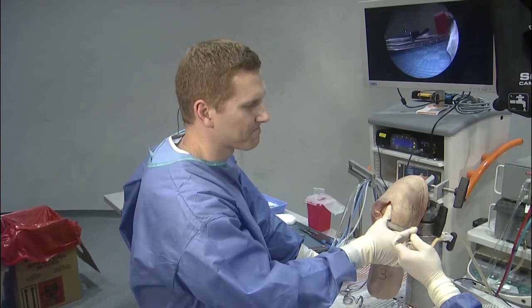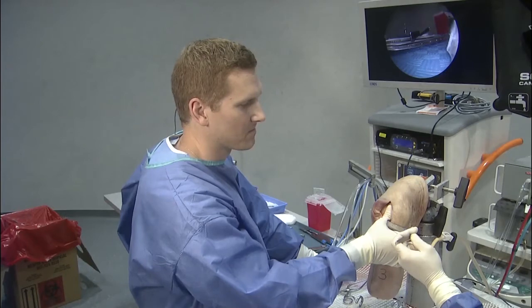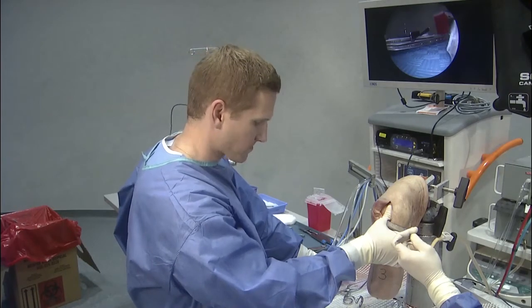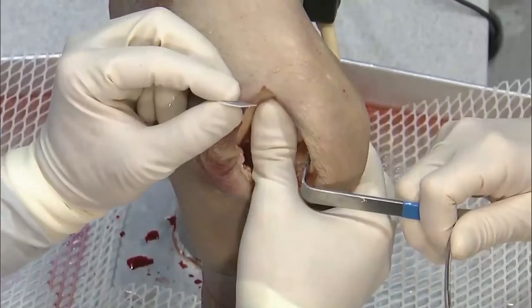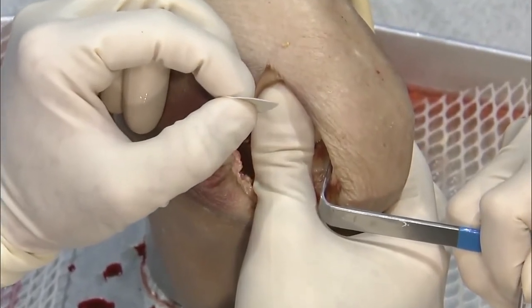Yeah, the other thing that's a little different about some of the cell-based matrix associated technologies is the thickness of the implant. Sometimes the thinner implant's nice because you know it's not going to be proud compared to the surrounding cartilage. Some of the implants are a little bit thicker, and I've had some concern that they're too thick for the surrounding cartilage, and they really sit proud, and there's not really any way to adjust that. So this is probably the thinnest one that's there. I don't know if you're able to see this with the camera, but it's 0.43 millimeters thick. So it's very thin. And I'll show you once we get done.